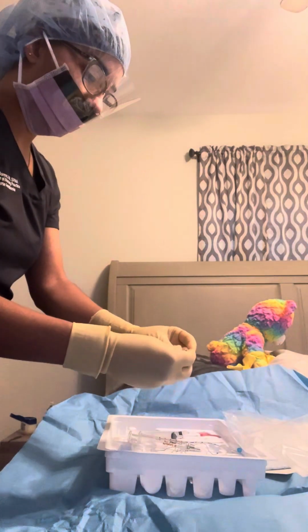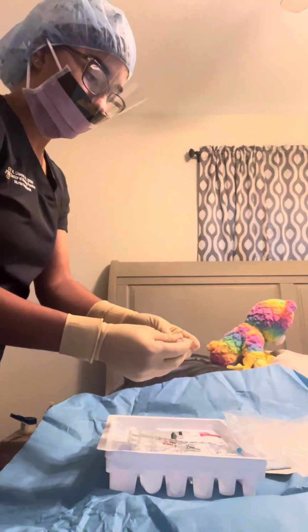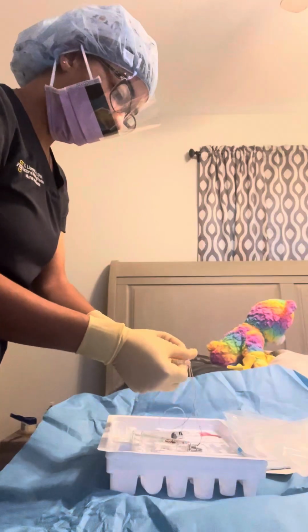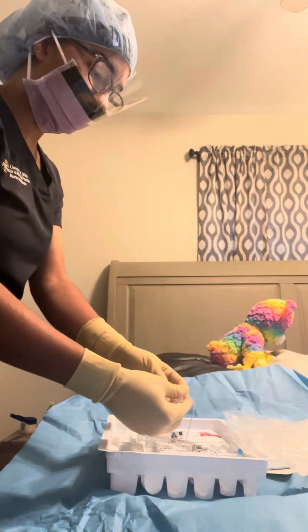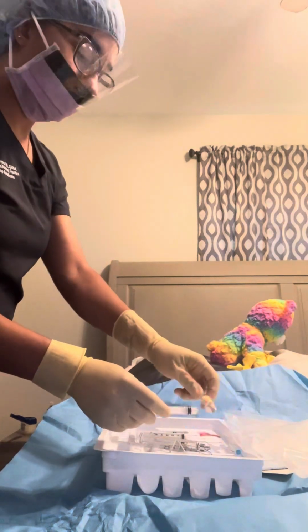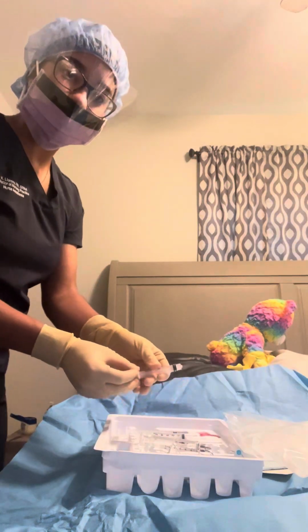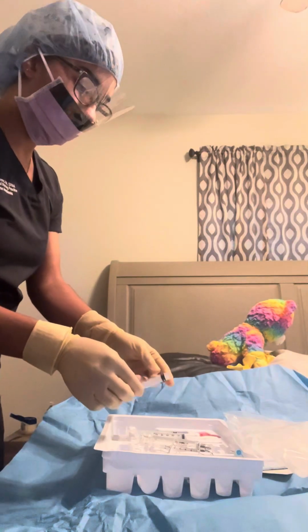I'm going to verify that I have lidocaine 1.5% with epi 1 to 200,000. And I have lidocaine 1% and then normal saline. In a 3 cc syringe, I will draw up lidocaine 1% with the help of an assistant to make sure I don't contaminate the ampules.